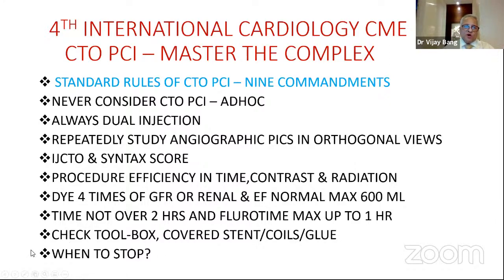And when to stop, you should be very clear in your mind. We all know that if the contrast dose is exceeded, you need to stop. If fluoro time is exceeded, you need to stop. And if there is a complication, you need to stop. So these are the factors which we need to keep in mind.